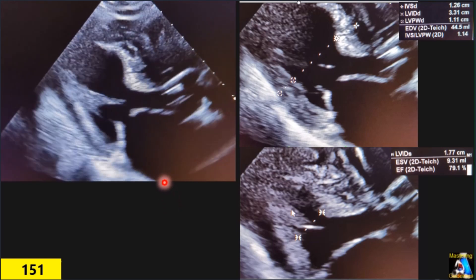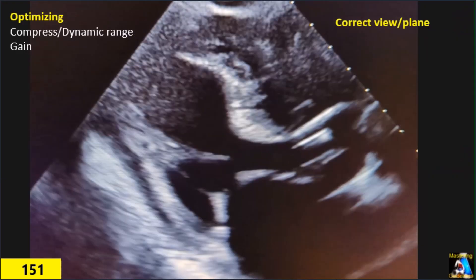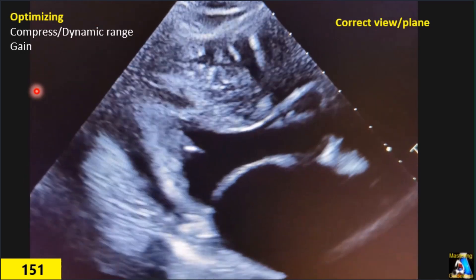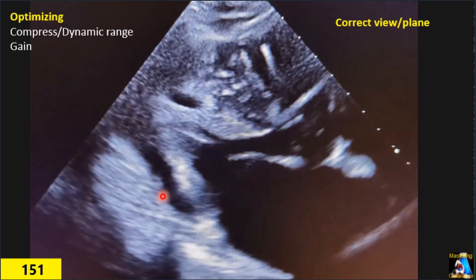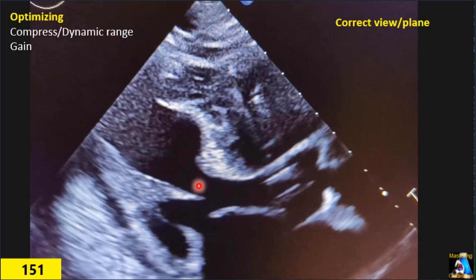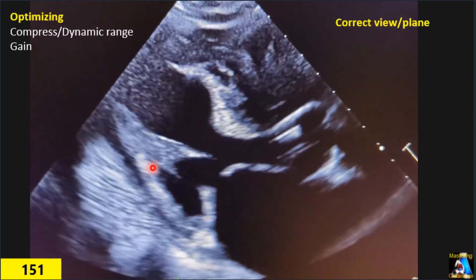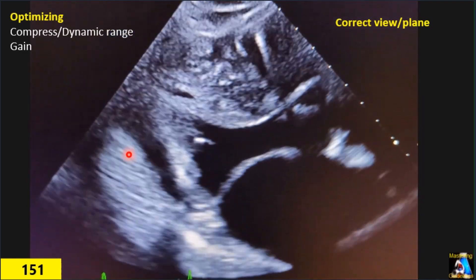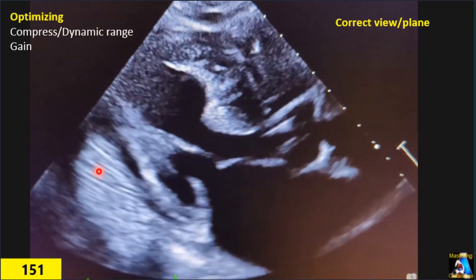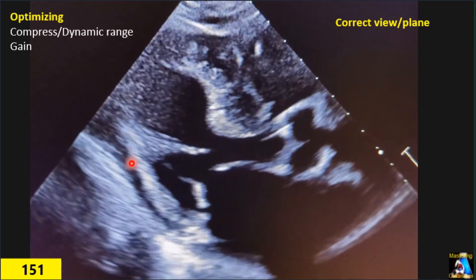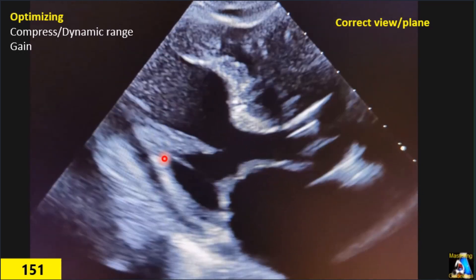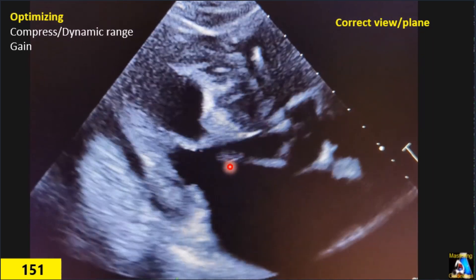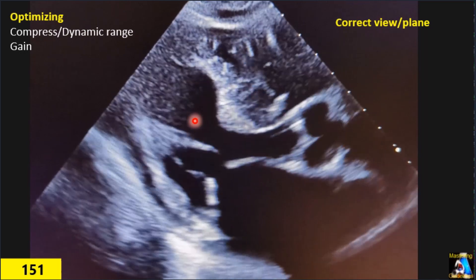Now let's see where the mistakes are and how we can prevent them. Starting with image optimization: the compression or dynamic range is very low, making the image very black and white. It appears this tech has some vascular experience, as the myocardium appears completely black — dark, almost hypoechoic — but based on the pericardium, I can identify the myocardium, and the hyperechoic line is the endocardium.